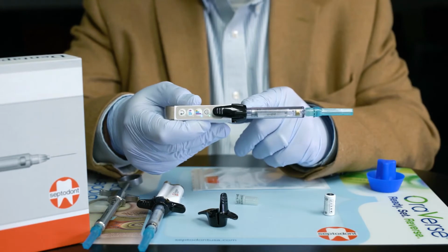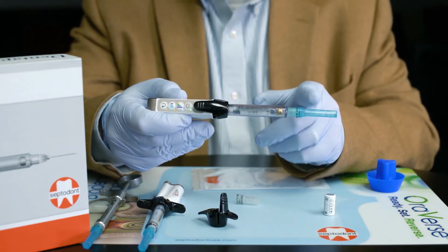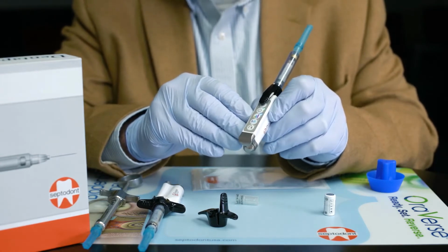When I turn it on, the plunger advances a small amount. It's going to deliver a small amount of anesthetic to prime the needle. It's best to leave the cap on during that stage. Now the device has 3 speeds, and as we said before, slow is less pain.